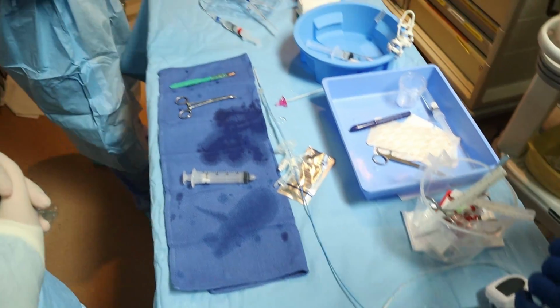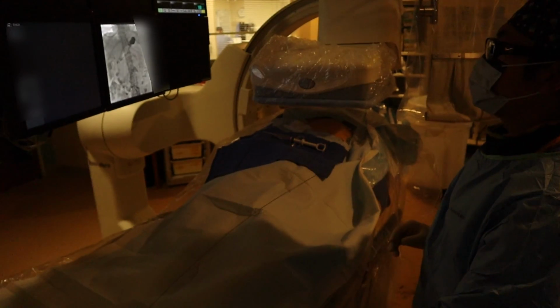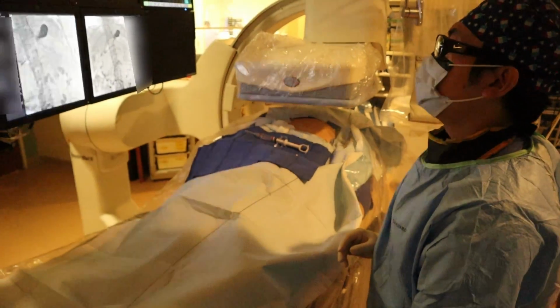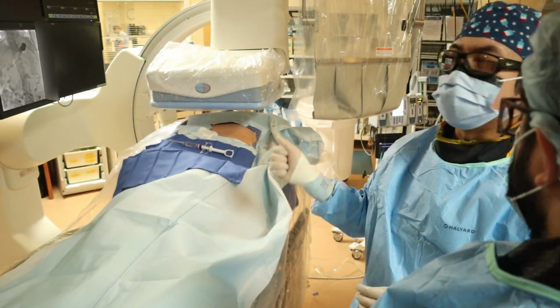Okay, the first part is to assess the window. So we're going to take a quick look at her prep area. We gave barium last night to visualize the bowel. It's still moving along, mostly in the small bowel now. Some has reached the right colon here, so it's kind of predicted from CT. This is more like a midline G-tube, right?